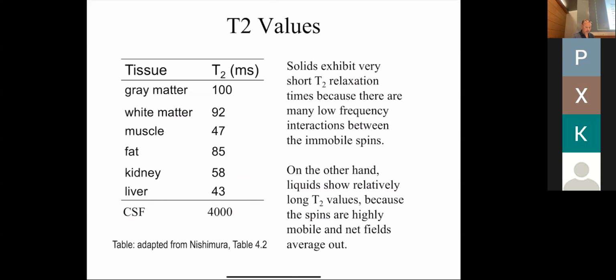So this actually becomes one of the things that governs how quickly we have to do things in MR. The signal that we care about is only hanging around for about 10 to 100 milliseconds. So that means we have to collect the data quickly, because if we wait longer than 100 milliseconds, there's nothing left. There's no more magnetization oscillating around that we can pick up. So that's why there's this emphasis on speed, that you have to acquire relatively quickly.